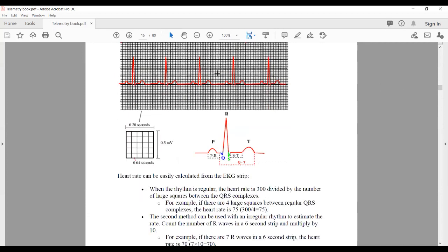And I know this is kind of difficult to see, but what you'll be looking at if you're working in telemetry or a cardiologist's office, he might be doing some telemetry. Definitely if someone's on a treadmill, if we're doing a stress test, it just depends what type of test you'll be running. Usually people that are on telemetry are in hospitals and they have telemetry technicians monitoring their heart rate on telemetry monitors. And we'll try to take a look at some of those live rhythms before the end of lecture today.